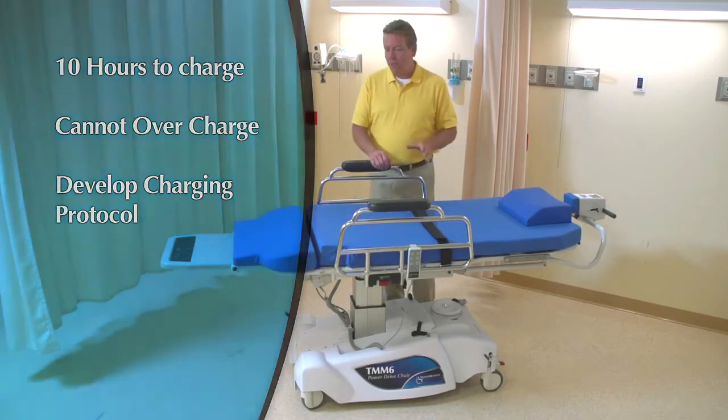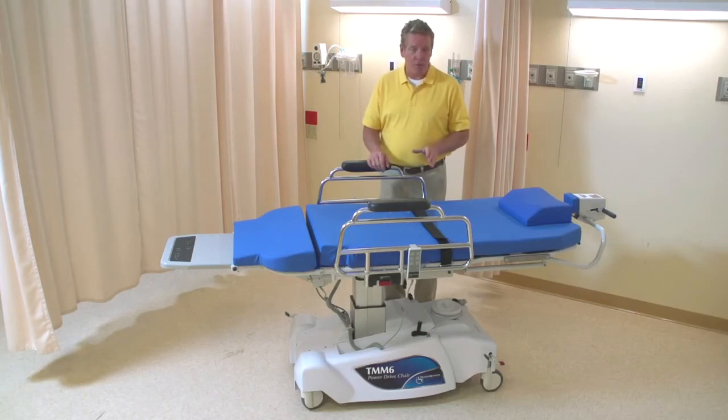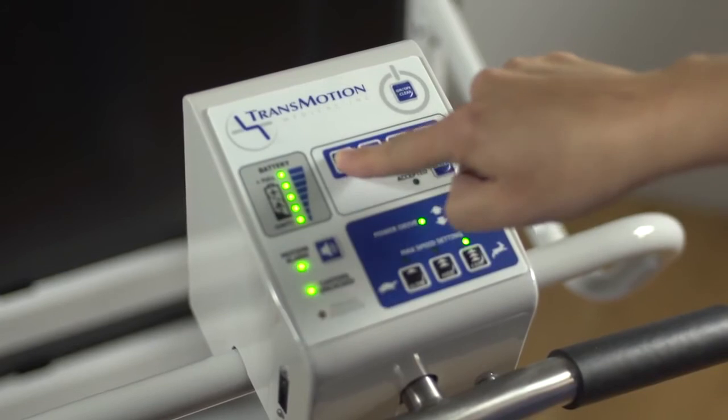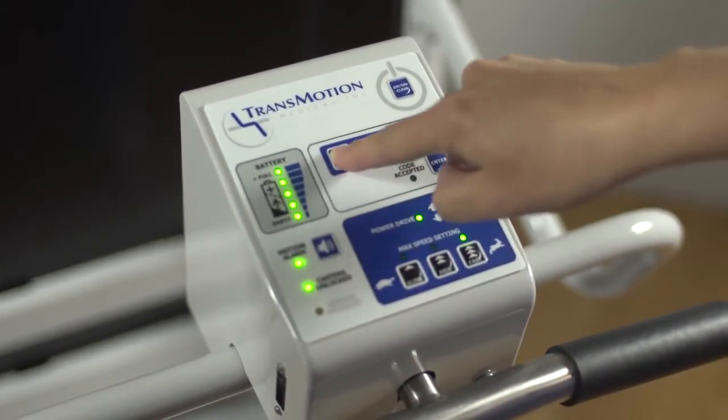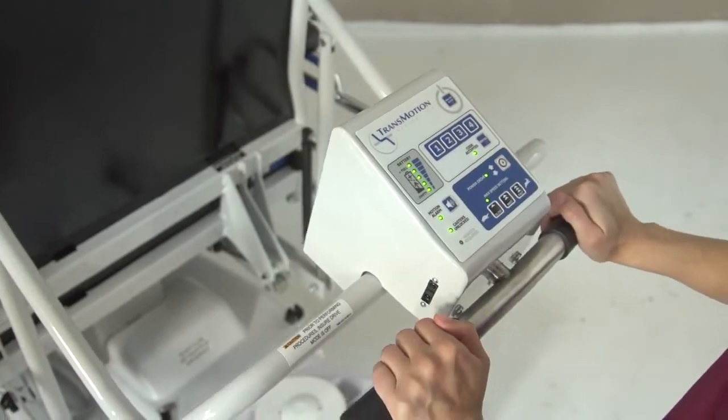Before we actually drive the TMM6, a word about safety. Transmotion Medical has designed the TMM6 with multiple features to ensure the safety of patients, caregivers, and visitors. A security keypad on the user interface ensures that only certified operators can use the power drive feature. The motion alarm lets operators add a warning sound whenever the chair is moving.